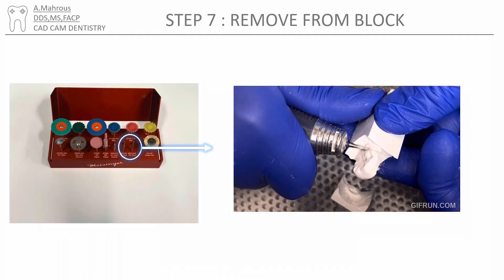You'll need to separate the crown from the block. This is usually done using the straight diamond. The crown will be very fragile during that stage, so be careful not to drop it and make sure to handle it with care.